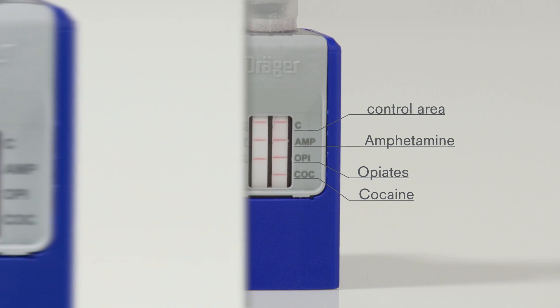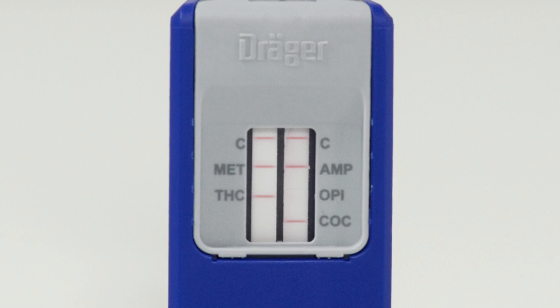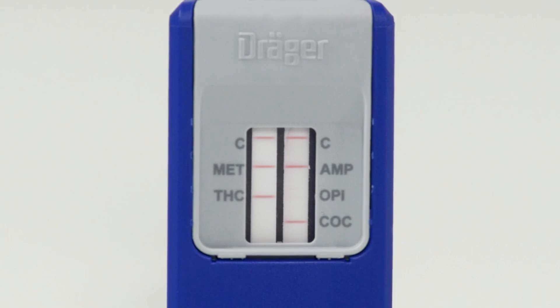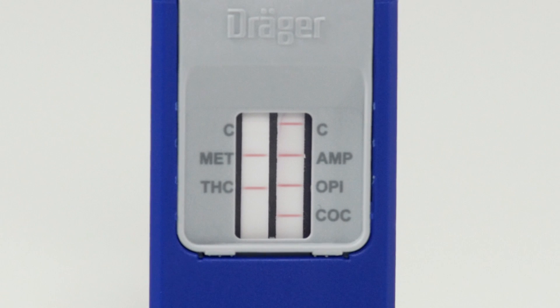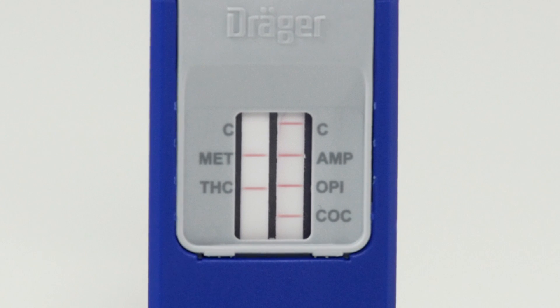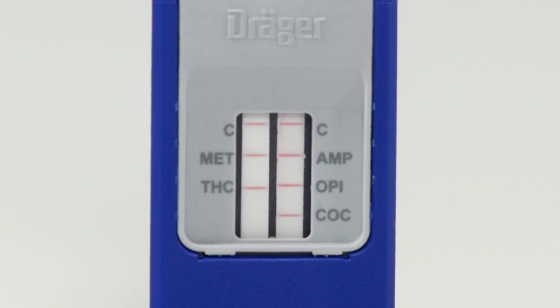If a line appears in the upper control area but no line appears next to one of the substances, the test is positive. This test is valid and positive for opiates. Should one of the red control lines not be visible within 10 minutes, the test is invalid. In our case, the test is negative — luckily for our test person.